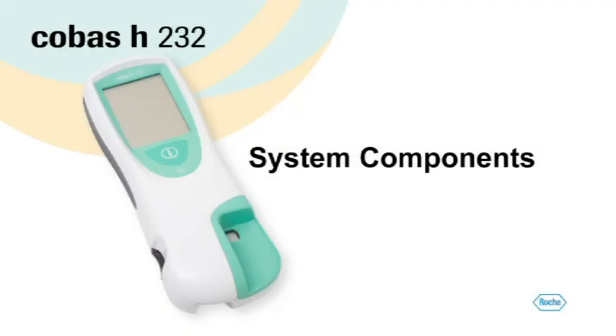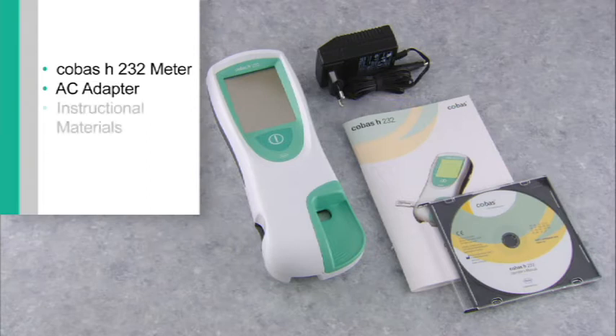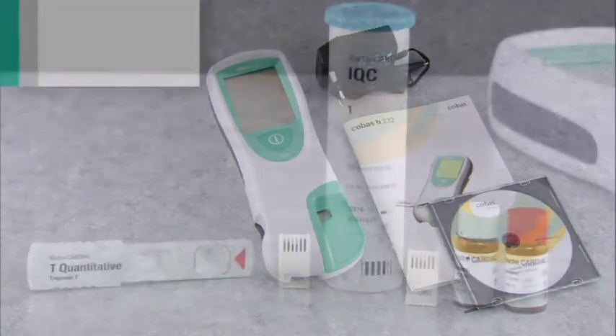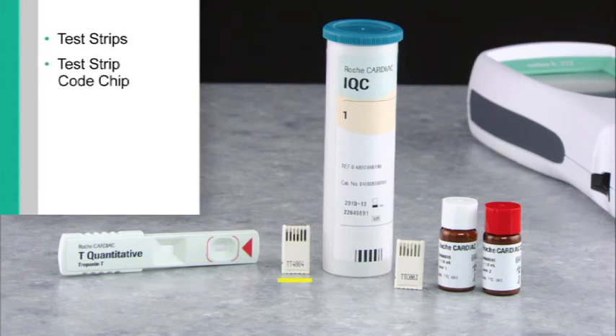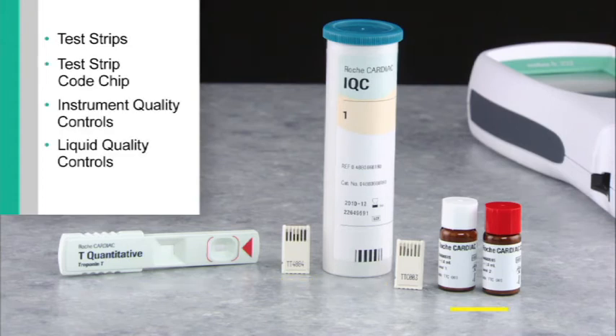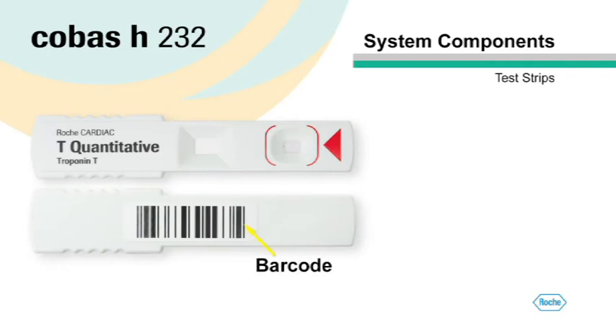Let's look closely at the components of the Cobas H232 system. The system includes the meter, AC adapter, and instructional materials. Please read and be familiar with the Cobas H232 system operator's manual and the test strip package insert. Additional parts of the system include test strips, a test strip code chip, instrument and liquid quality controls, and control code chips. On the top of each test strip you'll see the sample application area, and on the back you'll see the barcode.